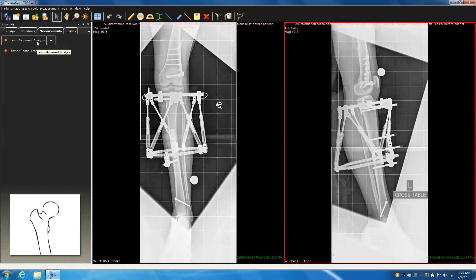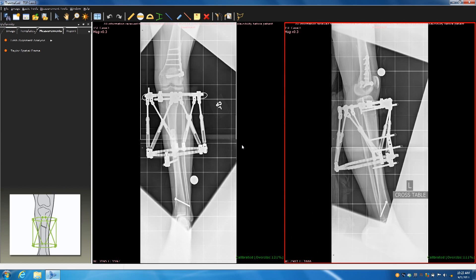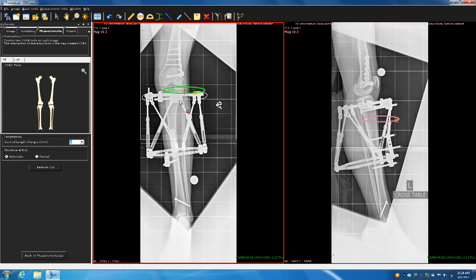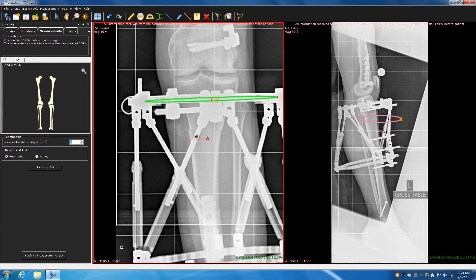Now you have the limb alignment done. If you go to TSF and hit TSF, it's going to ask you to make sure it's pointed to the right, and all of a sudden you have your template. All you do is simply adjust three things: you adjust your ring, you adjust your master tab, and you adjust your osteotomy site. Take this little line and make it mimic your ring. Remember, it's the inner diameter of the ring that we're measuring in the TSF. You can zoom in, take the little square, and put it right over your master tab.